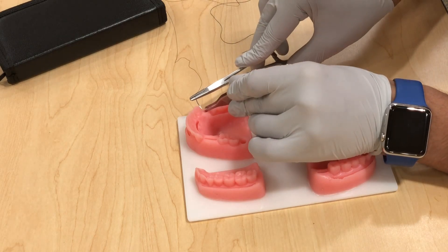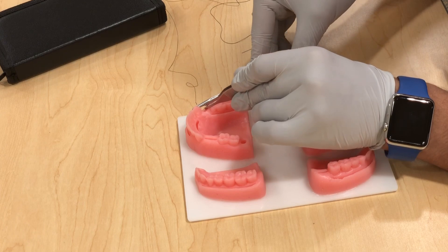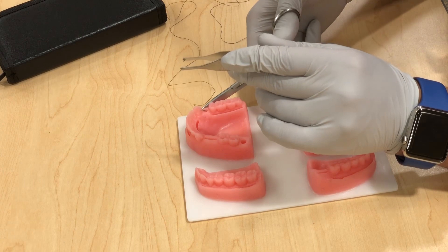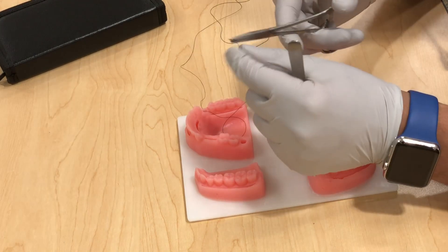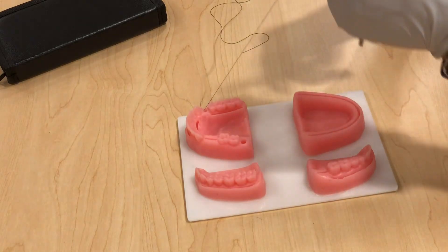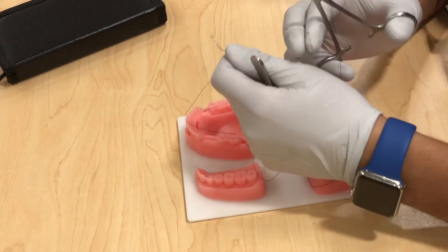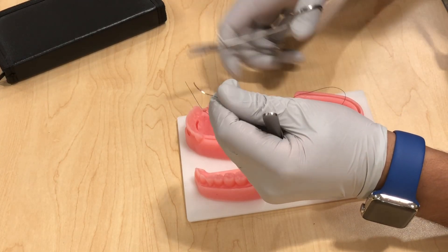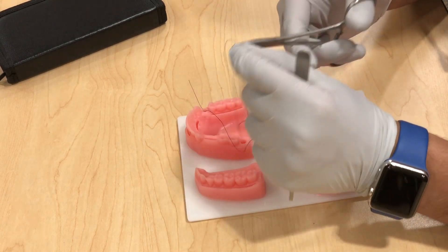Use your tissue holder to hold the tissue, then enter at 90 degrees through the tissue and assess how deep you want to go. Rotate like that — you can either do one bite or two bites at a time. Pull all the way through and leave a short end of about an inch.